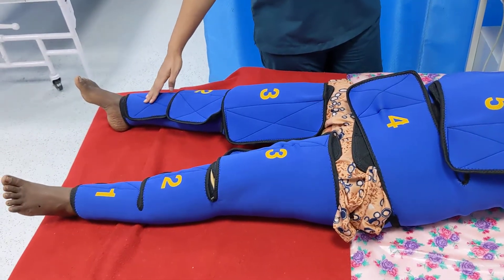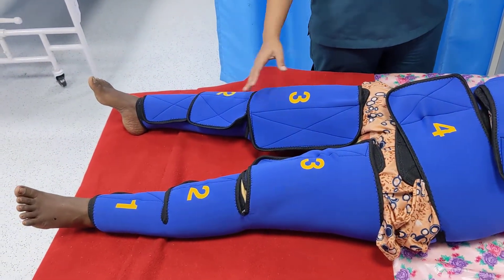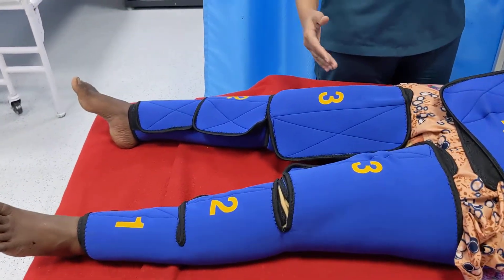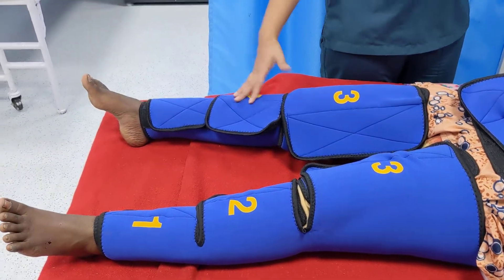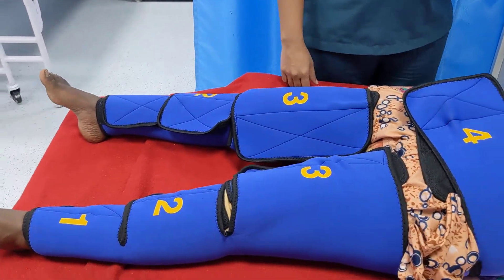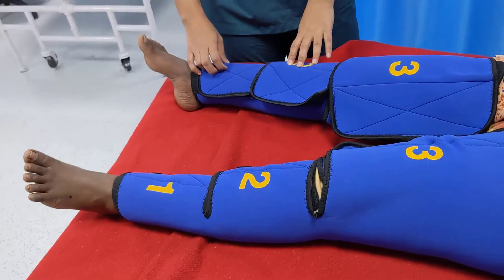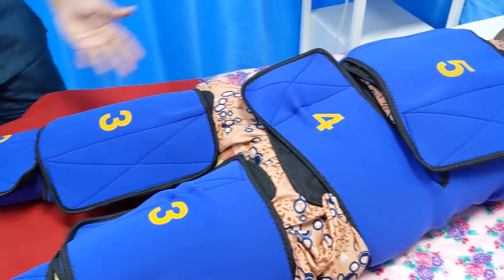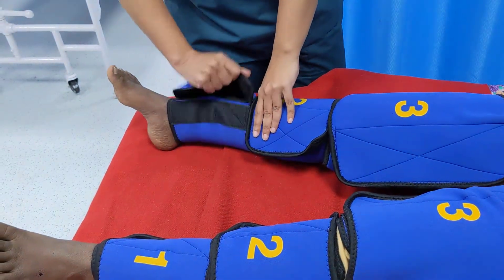As you go on removing the segments, at any point if the BP falls by more than 20 mmHg, you must rapidly close all open segments and look for the source of bleeding. This is called the Rule of 20. Just as the garment was applied from segment 1 to 5, removal also starts from segment 1.